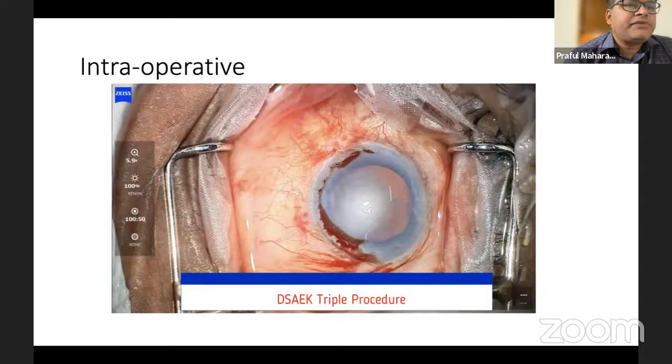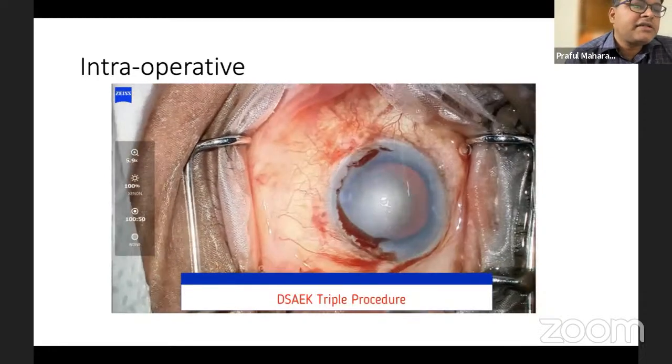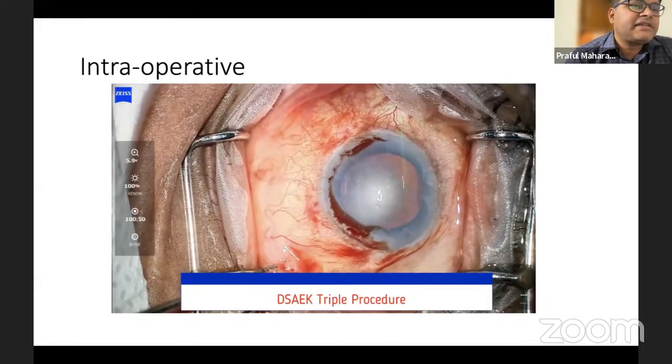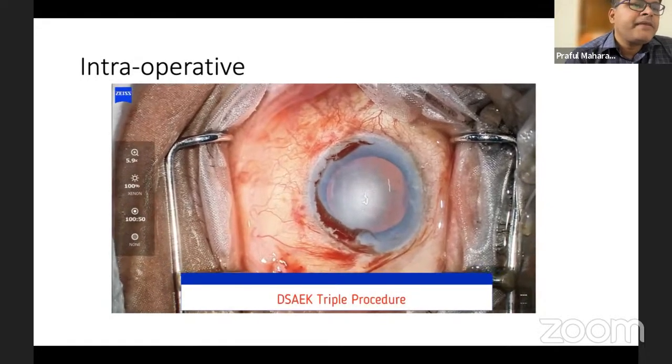Now here I will tell you a few tricks on how to do cataract surgery when corneal opacity is there. There is a paper by us, from a group from RP Center, in JCRS. You can go through that, cataract surgery in corneal opacities. But these are the tricks.